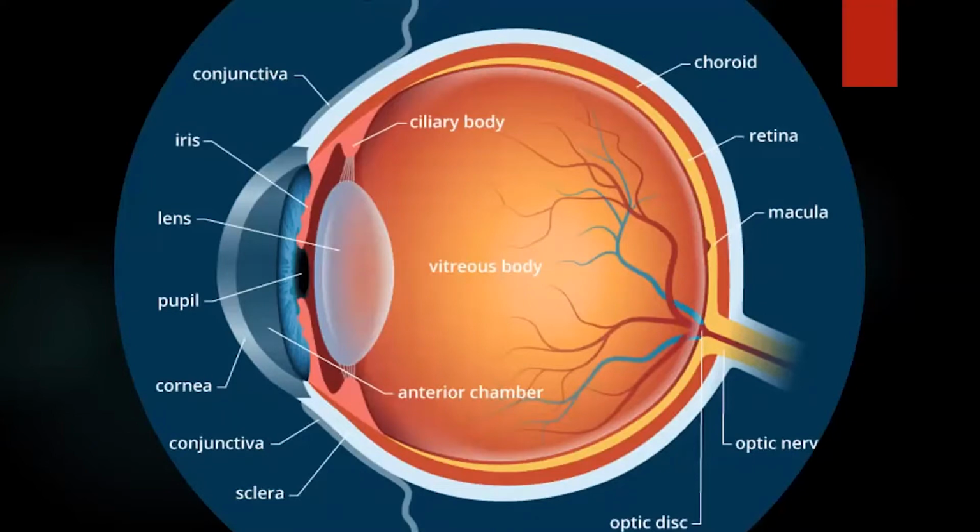Quick little overview of eye anatomy, as most of us hate the eye, myself maybe very chiefly included in that. Anterior chamber here, things that we evaluate more with slit lamp or Woods lamp, stuff we do at the bedside without any advanced imaging. Posterior chamber here, more where we're checking out with ultrasound. You've got your vitreous body, you've got your retina, which is attached to the choroid, and then your optic nerve. Importantly, here's the macula, which is going to be lateral to the optic nerve. So if you're looking at this eye, you'd say this is the right eye.